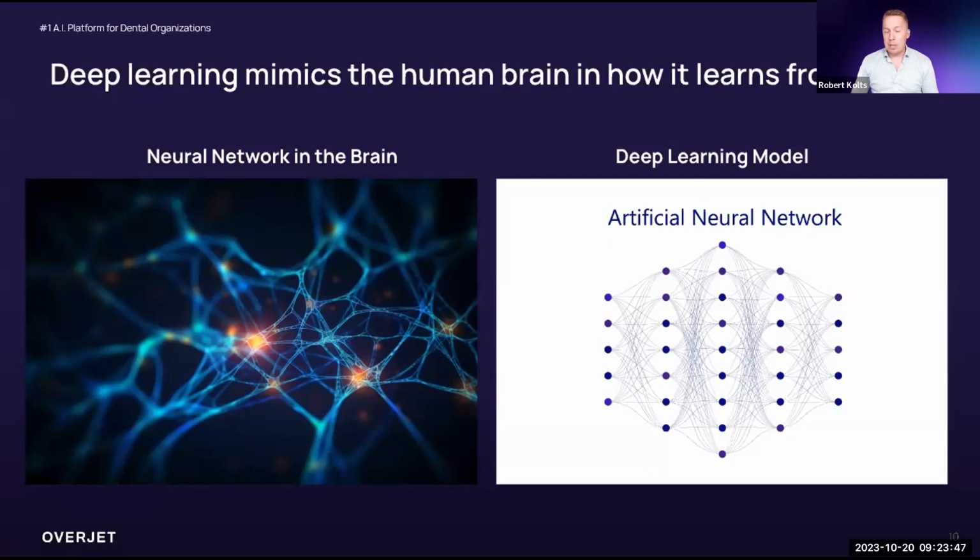It's its own association. And the reason we do that is I can't really describe adequately using words or an algorithm where or what caries looks like on an X-ray. Okay. For example, if I wanted to teach the model to find a square, that would be easy. I would say find a closed shape with 4 90-degree angles and 4 sides that are the same. And if you find that, then you found a square. Okay?